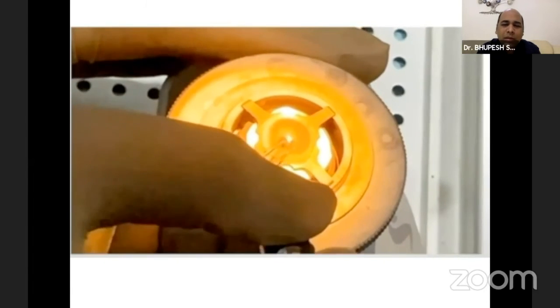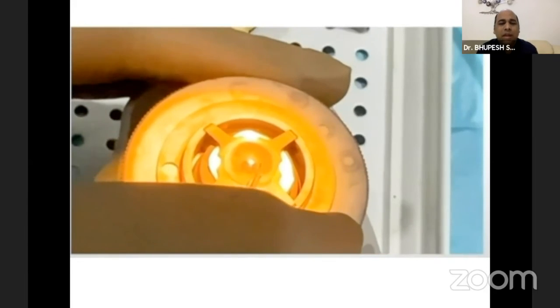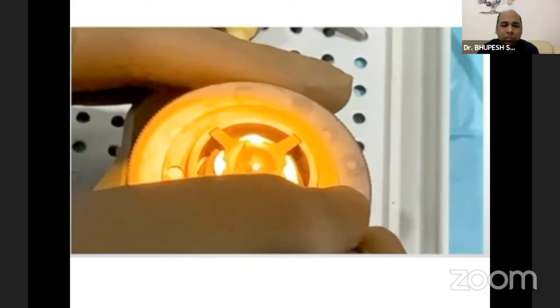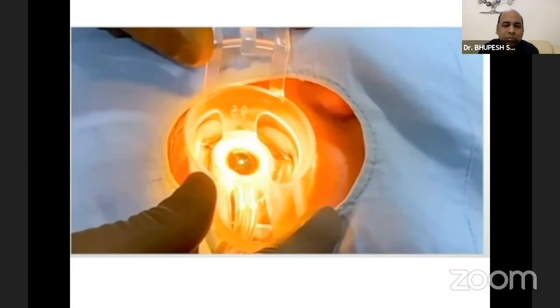Another important factor in femtosecond keratoplasty is that you don't need to take an oversized graft. In most of the cases, same size graft works well. So this is the donor. You just gently have to lift up.